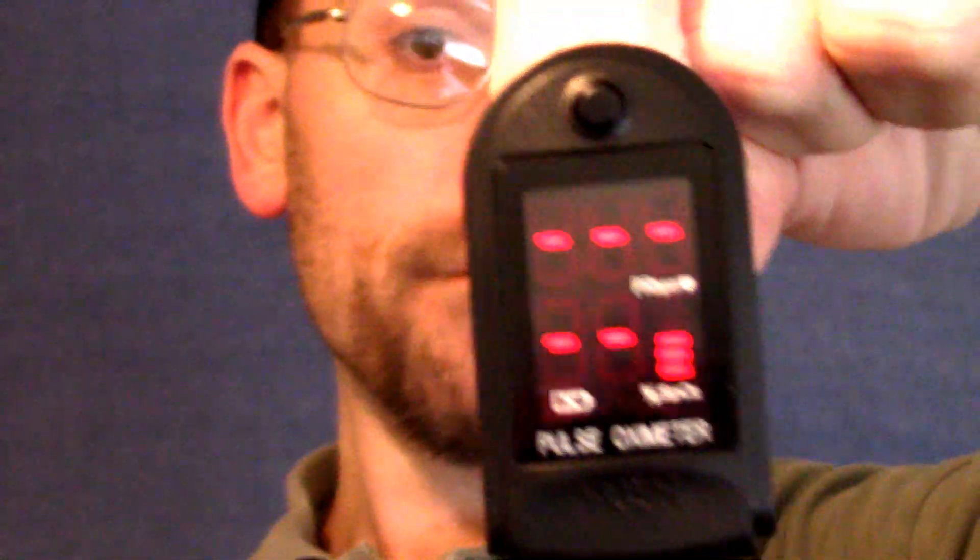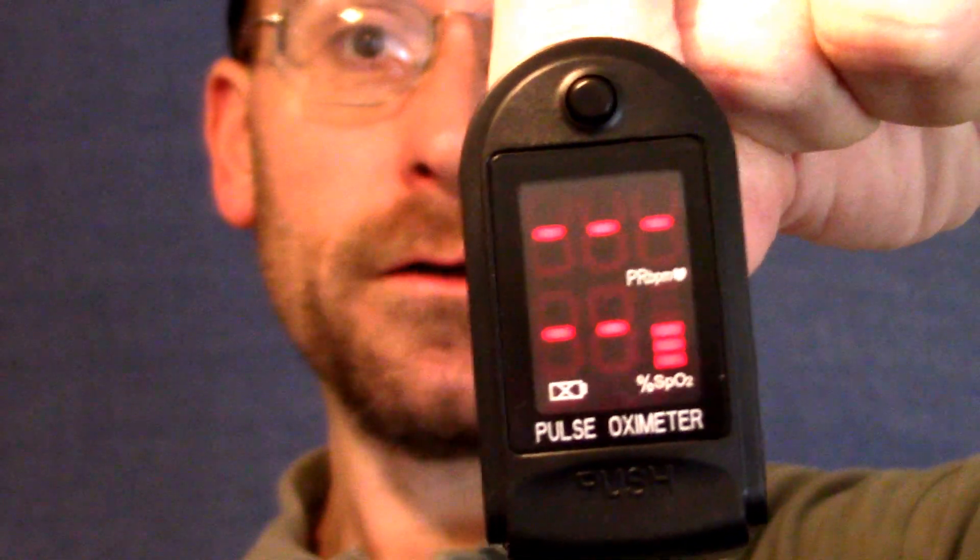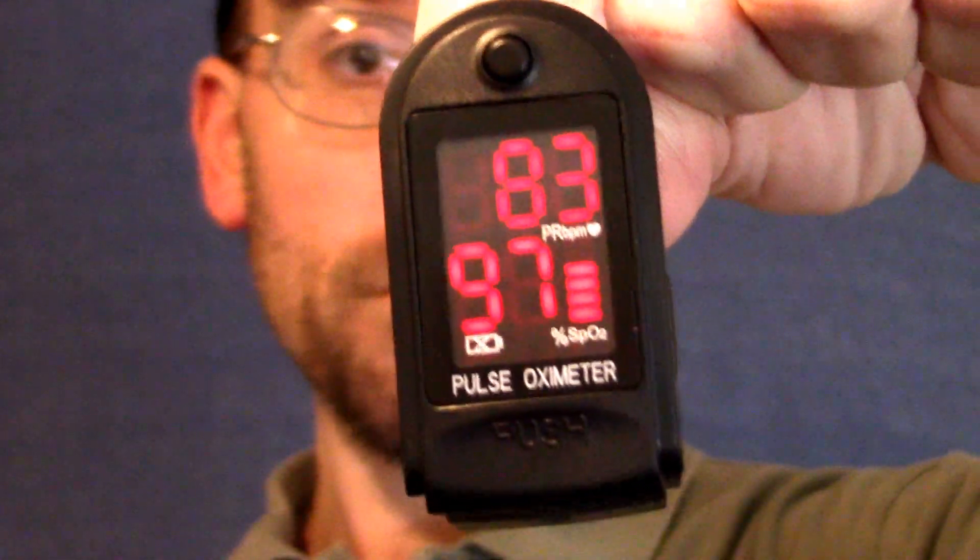Okay, let's see how this works. Essentially, we turn this on — this one here is just a push button. You put your finger inside of there, and there's a red infrared light and an invisible band coming together to approximate my pulse and oxygen levels.